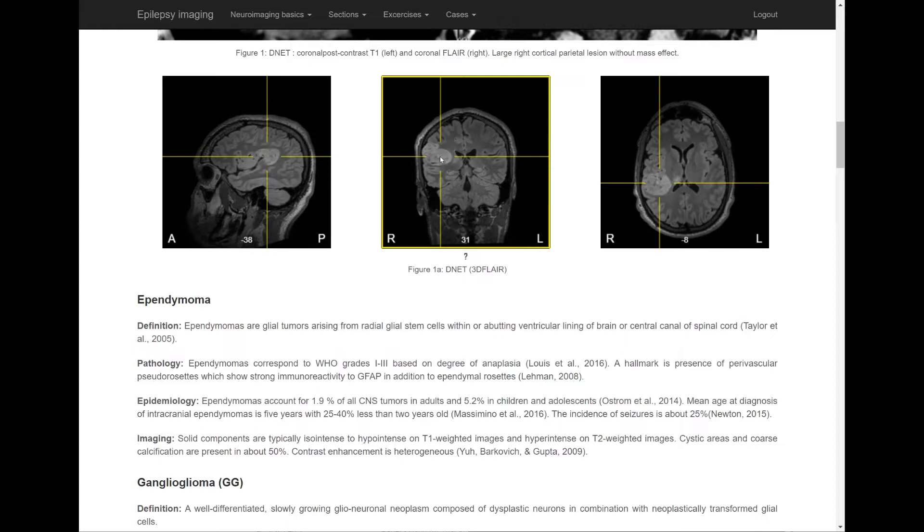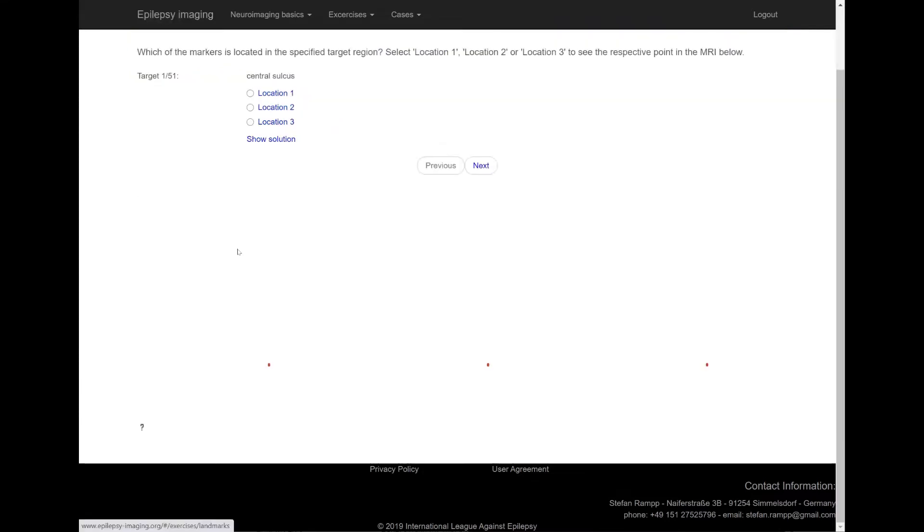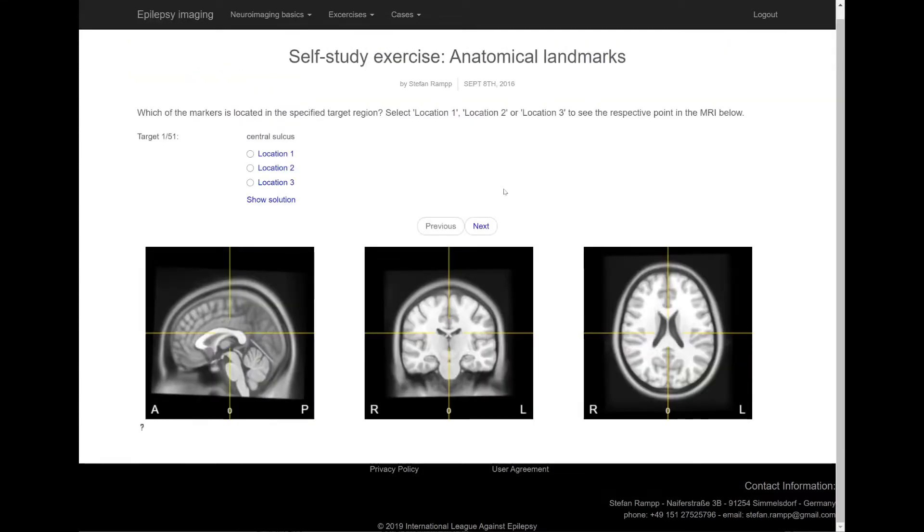Let's have a look at the next section. Clicking on Epilepsy Imaging takes you back to the main page. The Exercises section currently holds material to practice identification of several anatomical landmarks on MRI. Your task is to select the correct solution for the specified target out of a list of three suggestions.